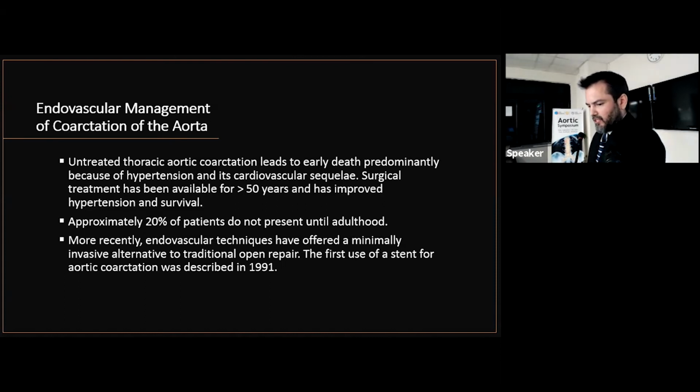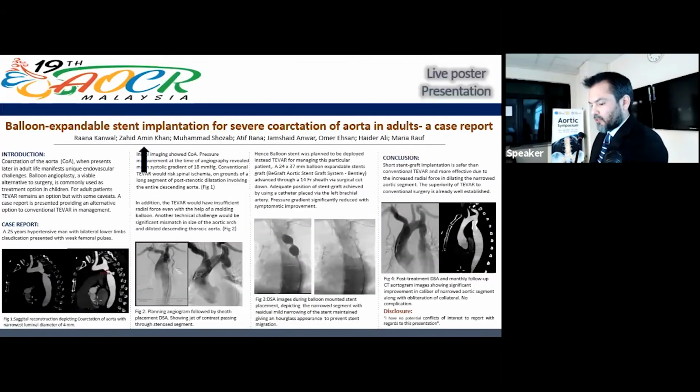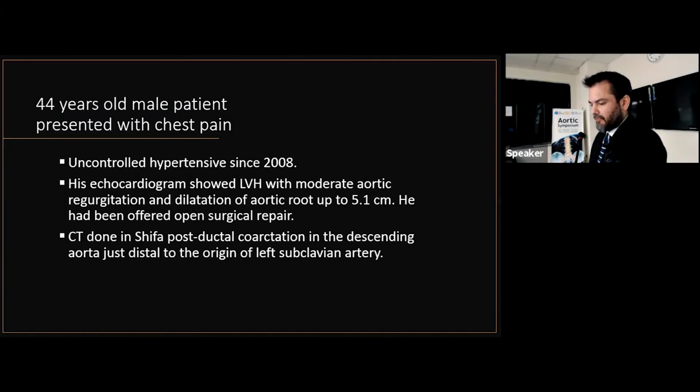Right, so endovascular management of coarctation of the aorta. So this is a childhood problem. Having said that, 20% of patients do not present until adulthood. So what do we do with these? Here's a paper, well, a poster that we published recently. And these are a couple of cases.